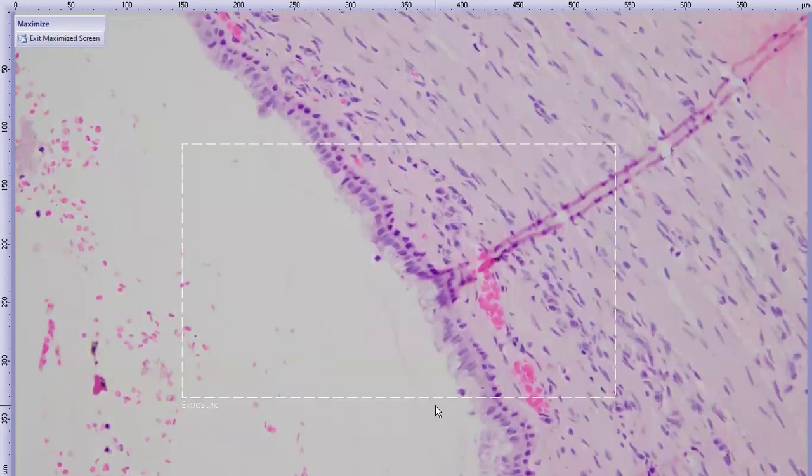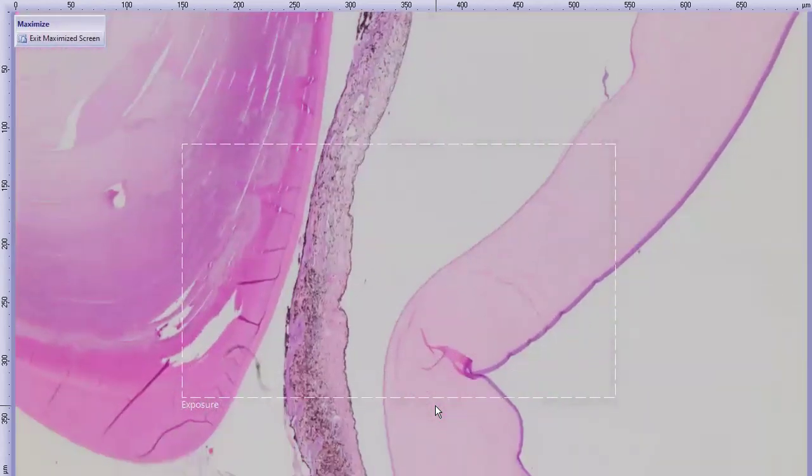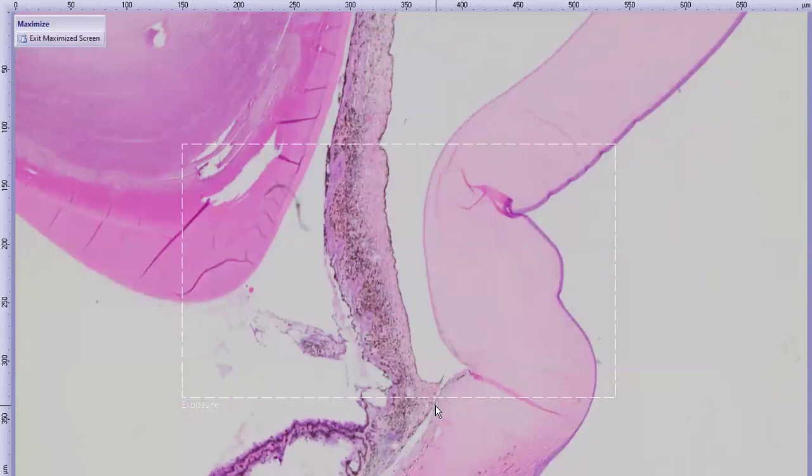Yeah, so that's a good reminder Megan's giving us, that blue-eyed dogs are not albino dogs, so they do have melanin. So the iris and ciliary body pigmented epithelium and the RPE cells, regardless of the color of the iris, regardless of the degree of pigmentation in these dogs, they will always be pigmented. Unless you've got a real albino animal like albino rabbits, where then you would not have pigmentation. So that is an excellent point as a reminder, and an excellent feature of these severe cases. Yeah. Great case. So that's one of the reasons why it may have been presented milder.